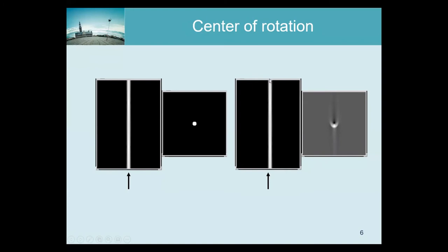That's perfectly fine. Then you would get that line, not in the center, but at a small shift. However, during reconstruction, we have to tell the reconstruction software that the rotation axis projected here. Then everything is fine. We can account for it. But if we then assume, which is typically done in the reconstruction software, that the rotation axis projects in the center, then we have a problem.